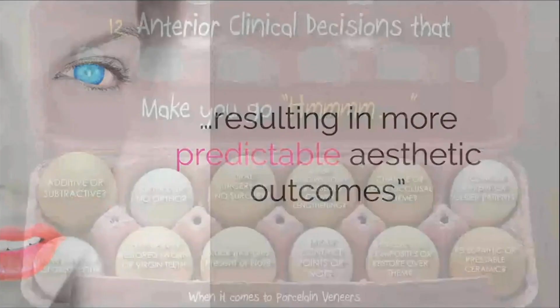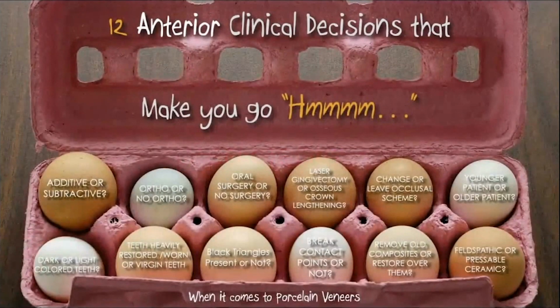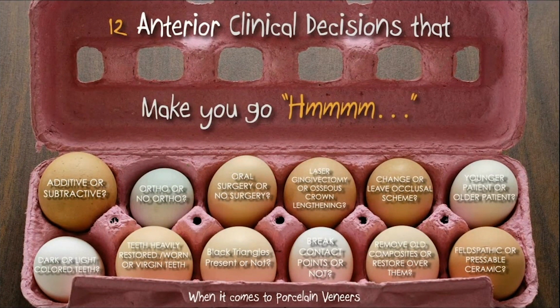All right. Here, I put this together a while back. For porcelain veneers, I guess it applies to all anterior restorations as well: anterior crowns, anterior veneers, three-quarter crowns. As you're planning cases, these are clinical decisions I would think about.